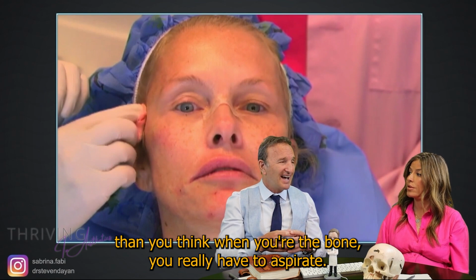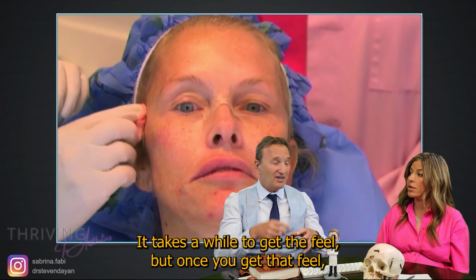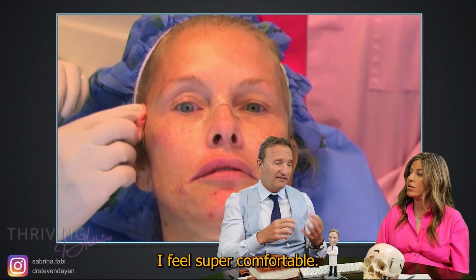You really have to aspirate. I think you have to use a lot more product. I really think this is a great technique for this. It takes a while to get the feel, but once you get that feel, I feel super comfortable.